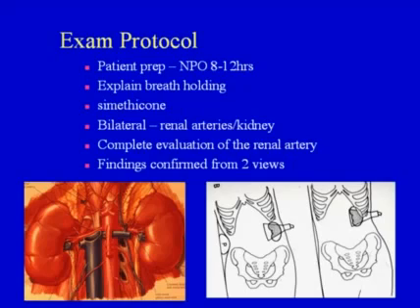even though they've been NPO. When the patient arrives, you should explain the breath holding techniques, because it's critical that when you need the patient to hold their breath, when you found a stenosis, that they don't take too big of a breath and completely move the vessel out of your field of view.